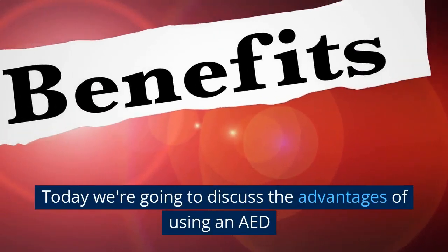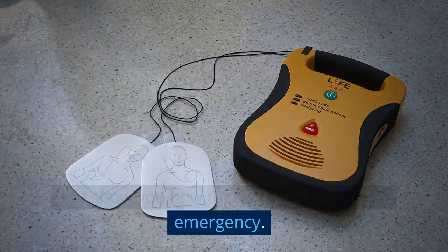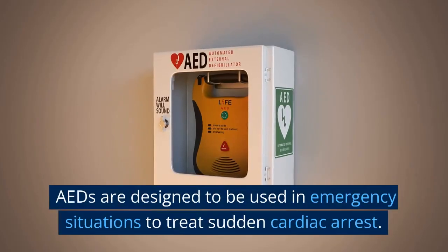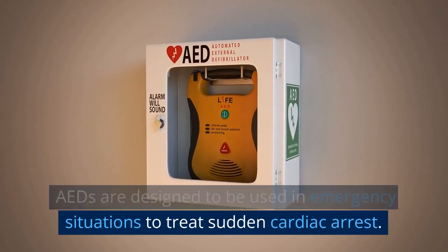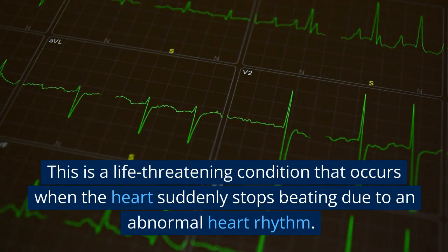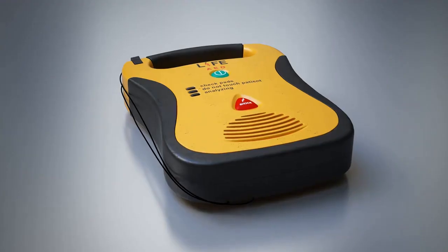Today we're going to discuss the advantages of using an AED, and show you how to use one in case of an emergency. AEDs are designed to be used in emergency situations to treat sudden cardiac arrest. This is a life-threatening condition that occurs when the heart suddenly stops beating due to an abnormal heart rhythm.